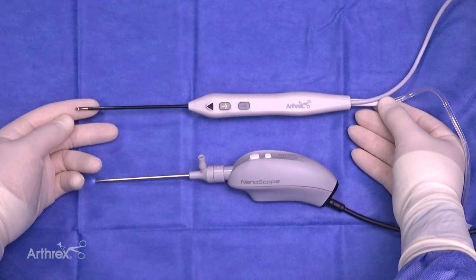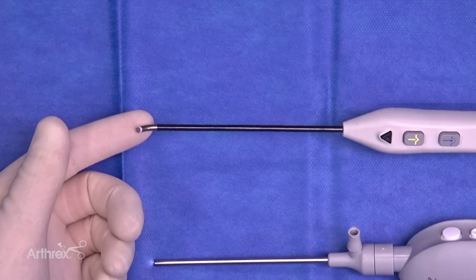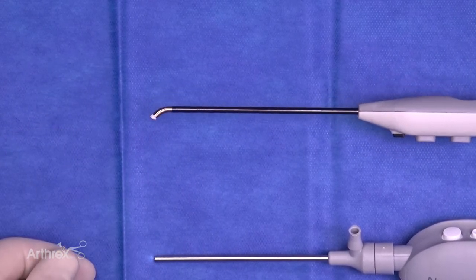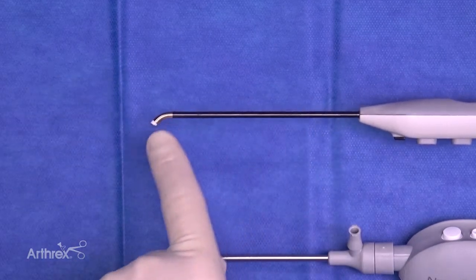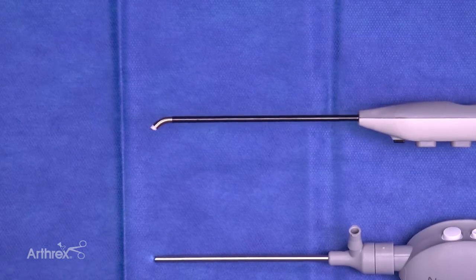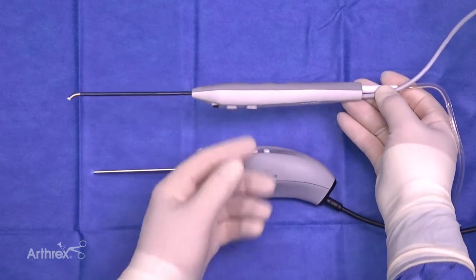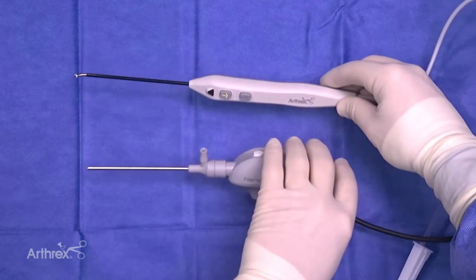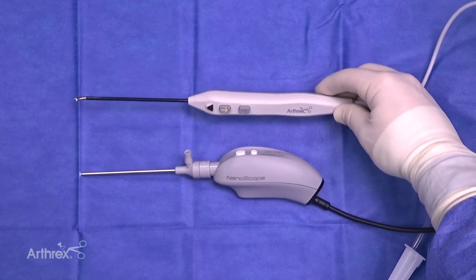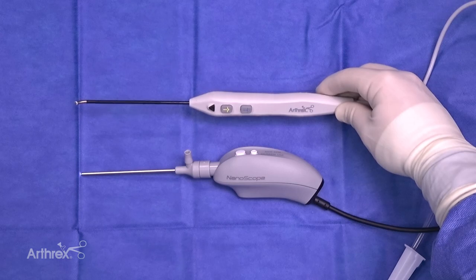I want to highlight a new Apollo Bipolar RF probe that's available. This is a little bit smaller than the one that we're all used to. Similar to the larger Apollo probe, it has that anatomic 50-degree curve to allow maneuvering in the joint space. But you can see this pairs really nicely with Nano Arthroscopy, and it's going to allow us to instrument those small, tight joints that will be very compatible with Nano Arthroscopy.